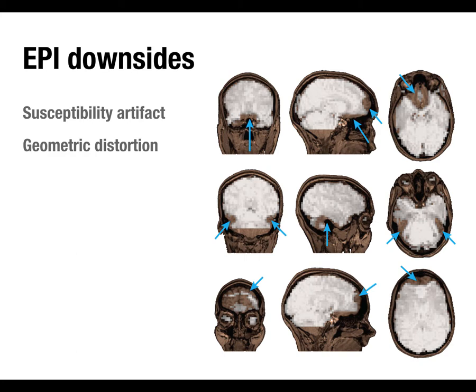I know for a while, instead of doing axial images, people were using coronal images, because again, just having the slice in a different plane, it cut through the air pockets differently and caused less distortion. Yeah. So out of just curiosity, if you were to run an fMRI on someone like HM, with the bilateral lobectomies, would it just be chock-full of artifacts and not all that useful?